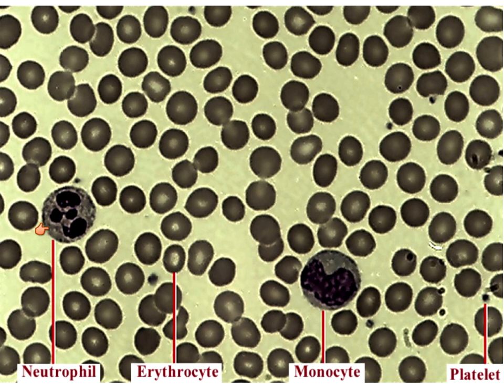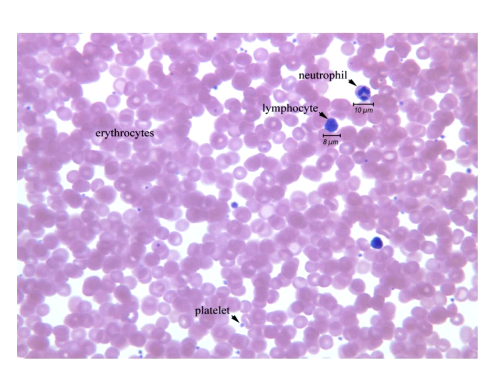If we look at this picture, we notice the trilobed or multi-lobed nucleus of the neutrophil. And then we have the monocyte — see again, you have that really globular shape. This one doesn't look like a C or a U, it kind of looks like a B. But you do still have that nice chunky size of the monocyte, especially in relation to red blood cells and other white blood cells. Your monocytes are going to be the biggest of your formed elements, which includes red blood cells, white blood cells, and platelets.